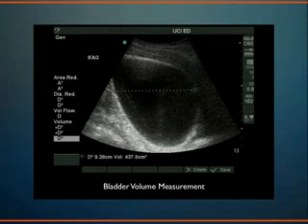The other thing is, on the other end of the spectrum, somebody comes in with acute urinary retention. They say, hey, doc, I haven't peed in 24 hours. And it's really easy to just say, okay, chuck a Foley in that guy, throw a catheter in that guy, and then tell me what comes out, which is sort of an easy thing to tell a nurse to do. But what if the bladder's empty because they're actually in acute renal failure? In an adult patient, it's extremely uncomfortable to put somebody through a catheterization process.